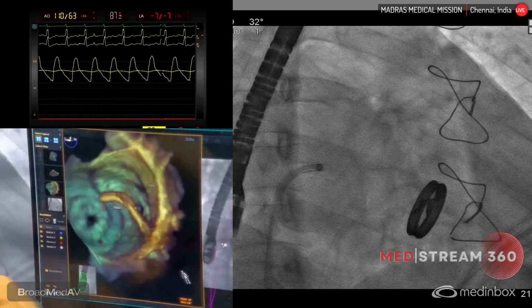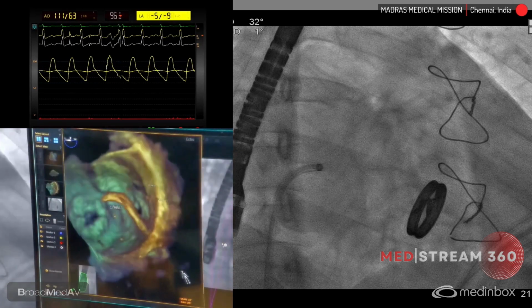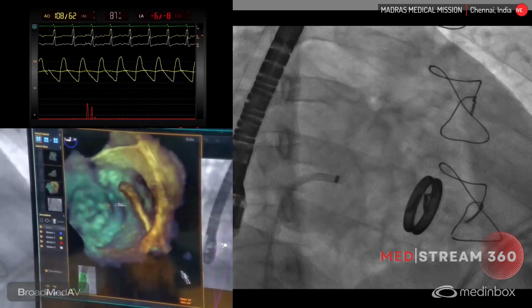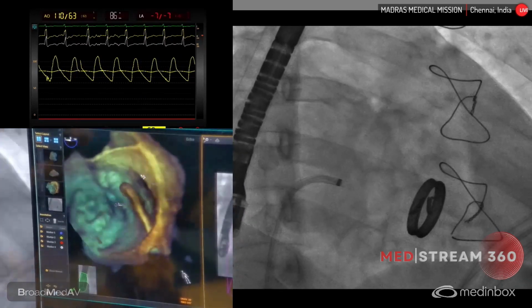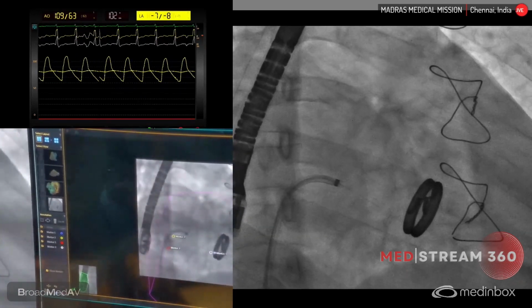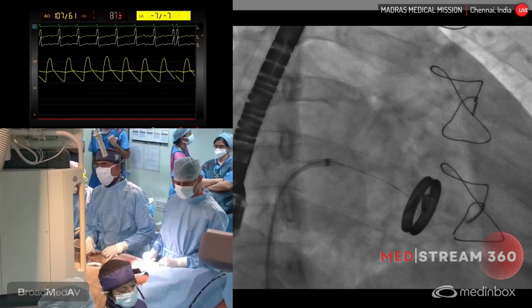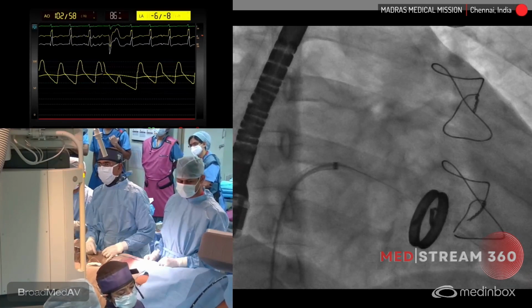The length of this catheter is short, and so I will need a 120 centimeter right coronary artery catheter. So currently what we are planning to do is direct the echo navigator more towards, I'll make this screen become larger, advancing the guide wire from this sheath. Okay, it's facing down. I need a little longer catheter. It's going through the valve into the mitral valve. So I will, that's a good anchor.